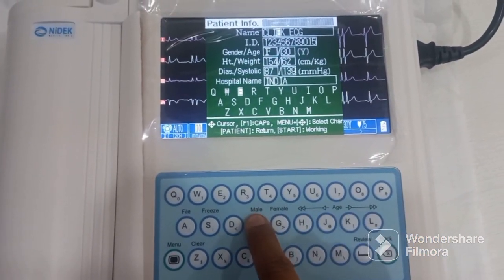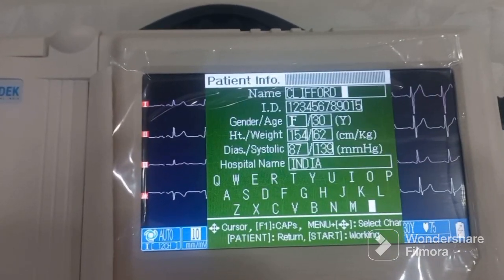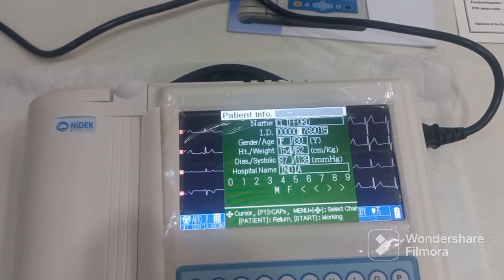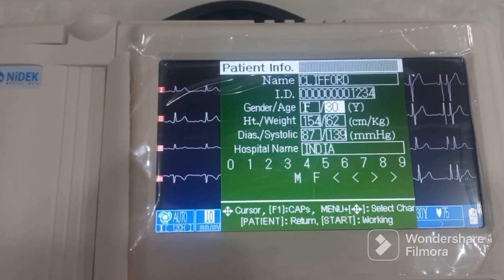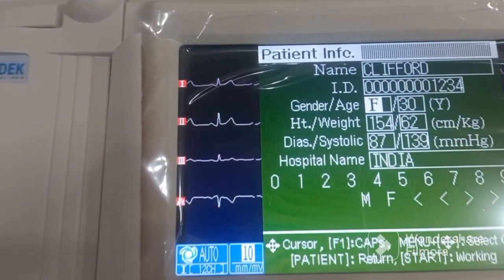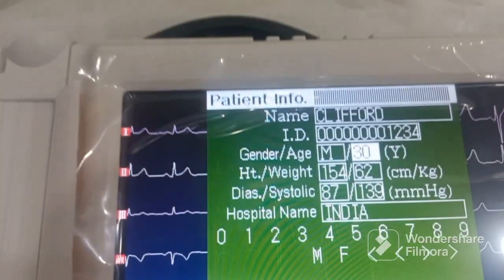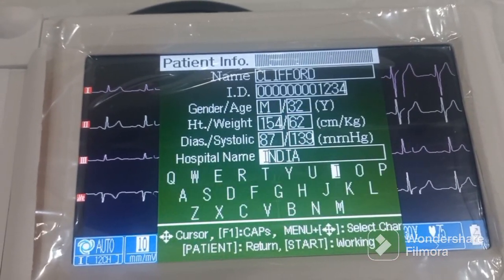Now we need to put the name of the patient — you can directly type it from the keypad. Then press the down arrow to put the patient ID. You can use the navigation keys to move around. Now we put the gender — there is a button for male and female, so just press male. Then you enter the age, height, weight, blood pressure, and hospital name.